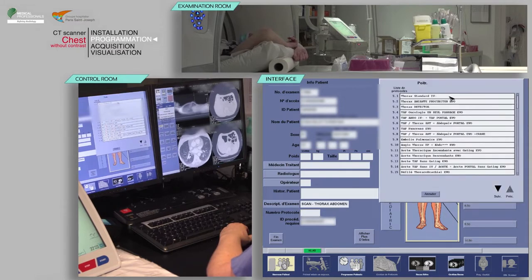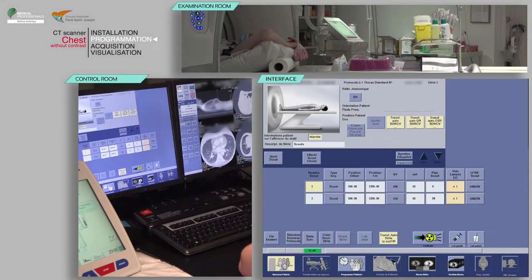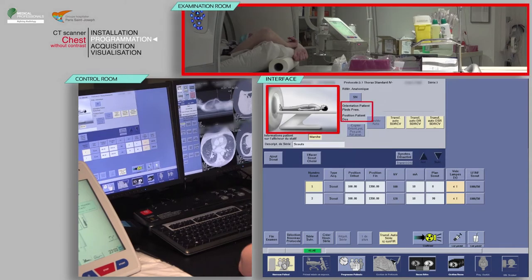Finally, choose the appropriate protocol. Check that your patient's position on the table matches with the one indicated.